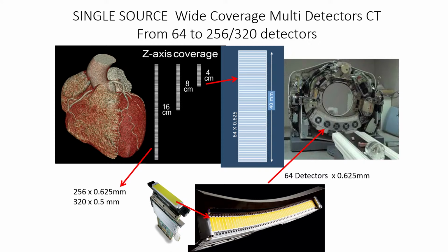Okay, so, but not everybody has dual source CT, but a lot of places, I think most of the places that you guys are gonna practice, probably gonna have some sort of wide detector, meaning instead of two detectors, you're gonna have one single source, but very, very big detectors, meaning 256.